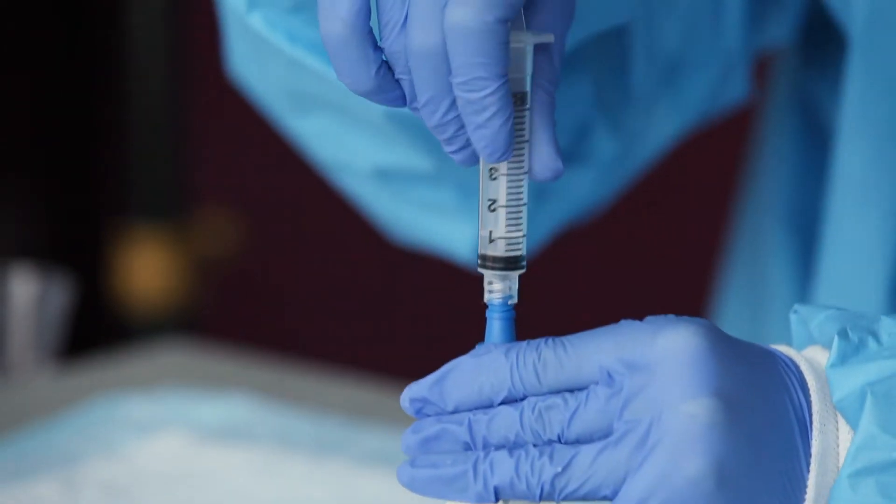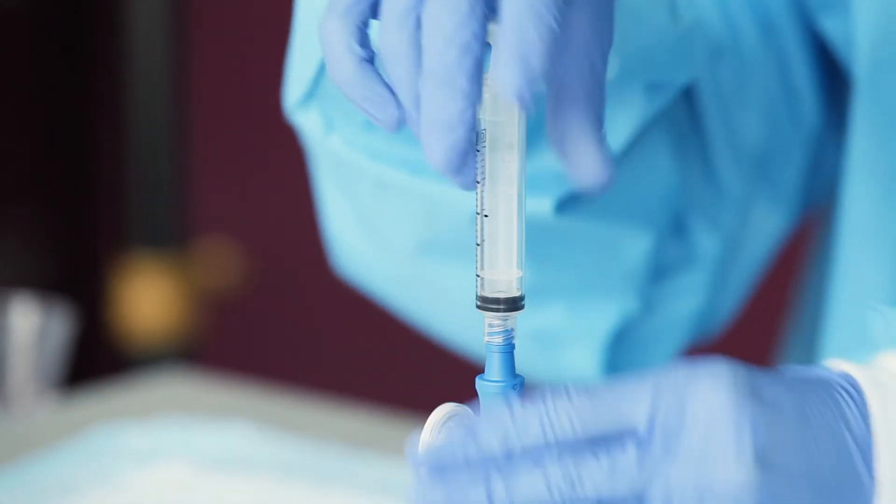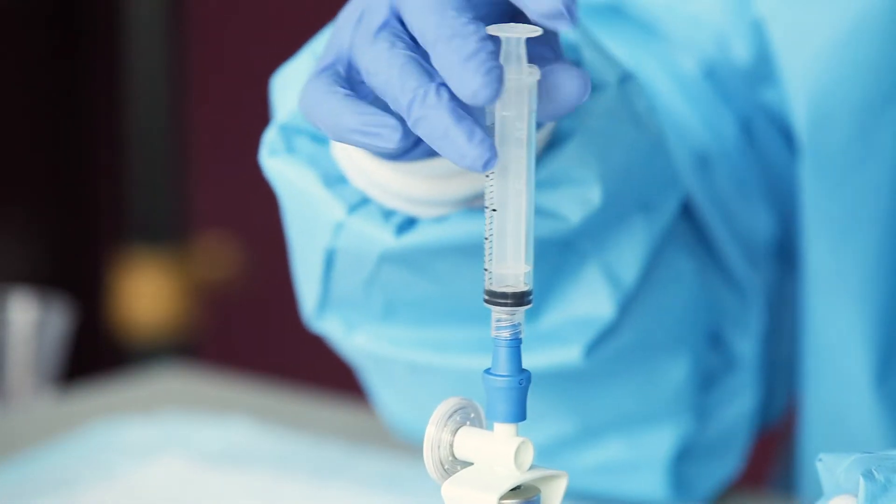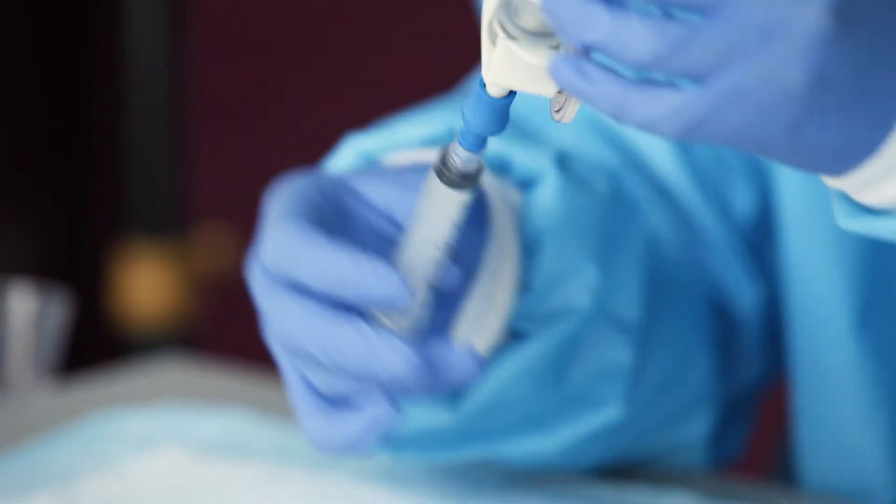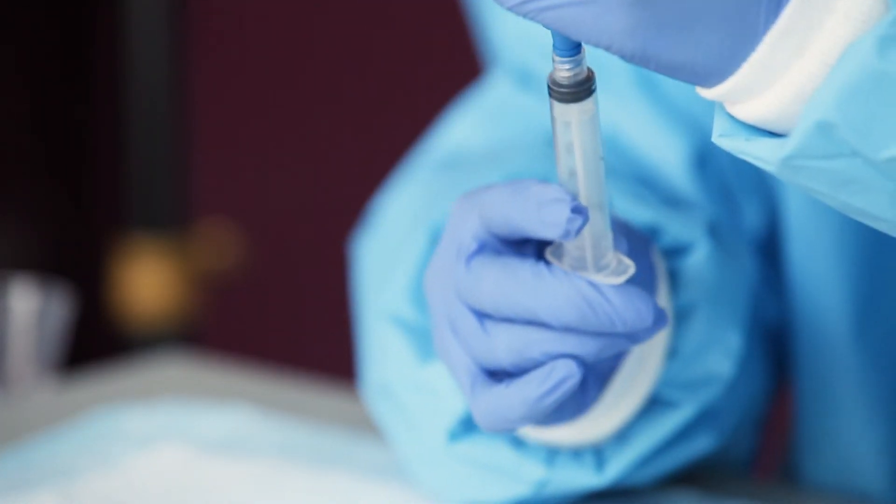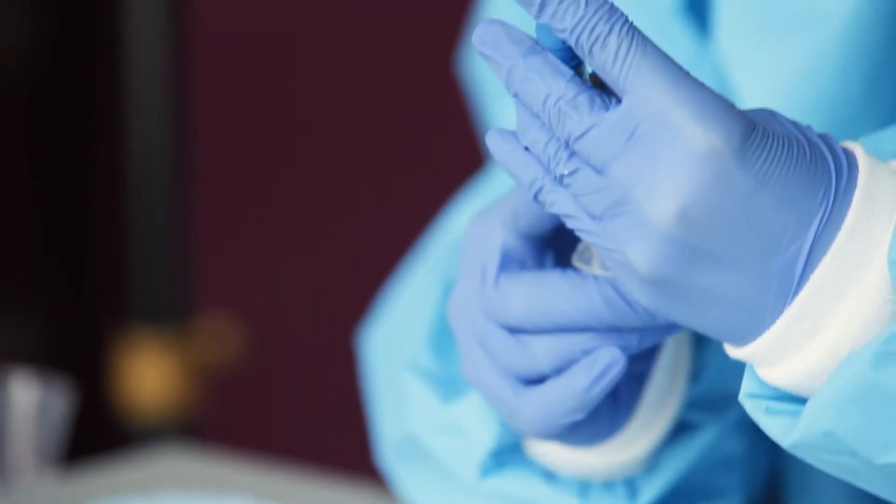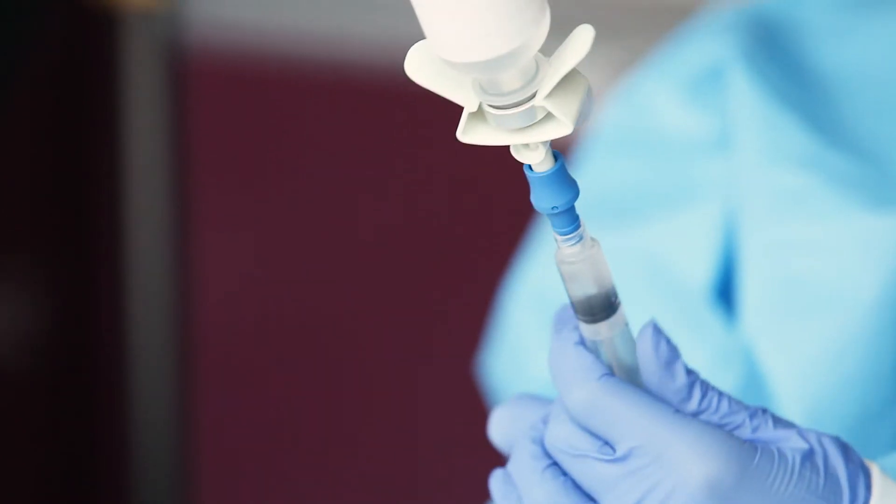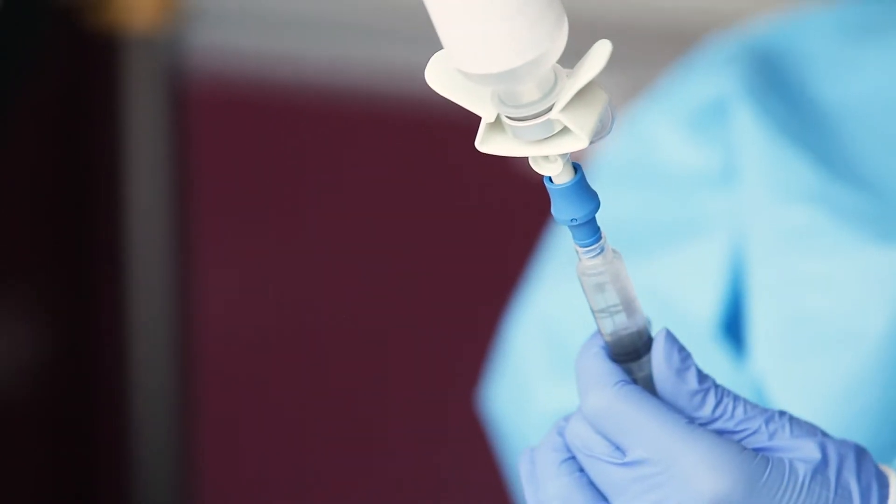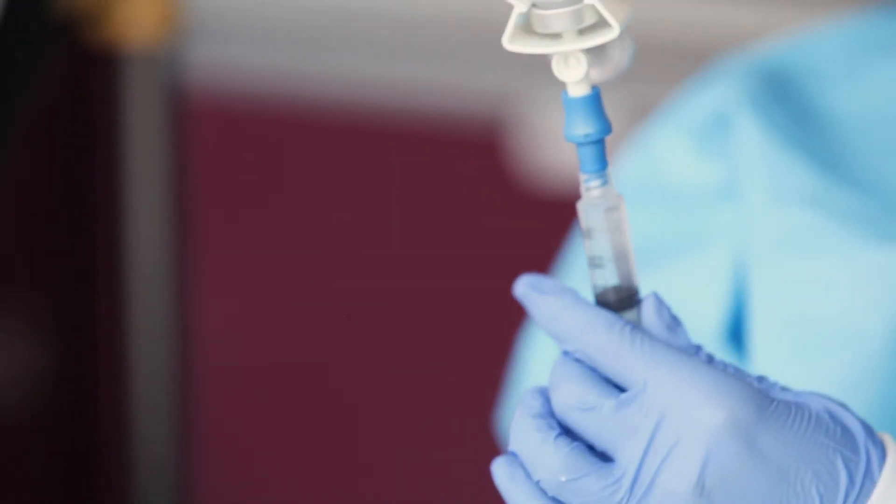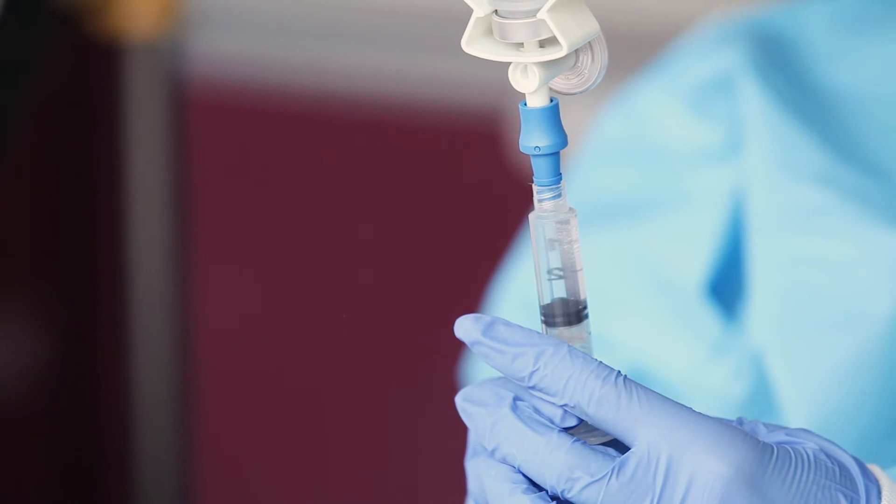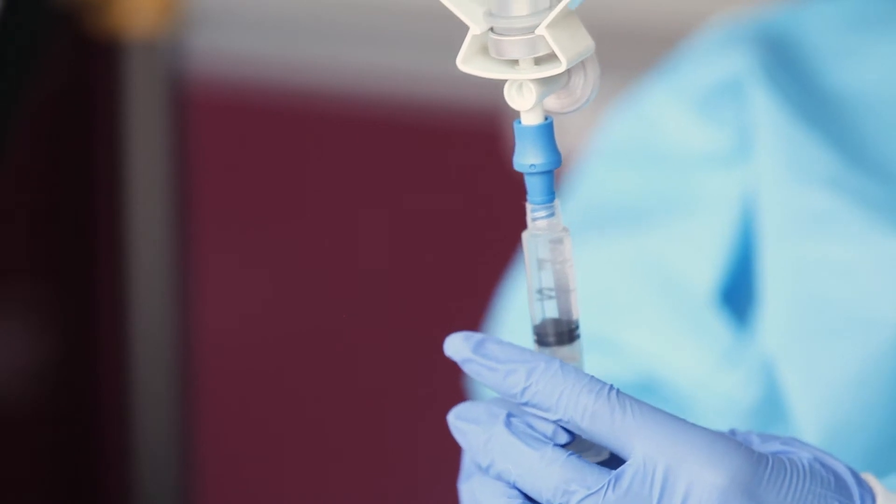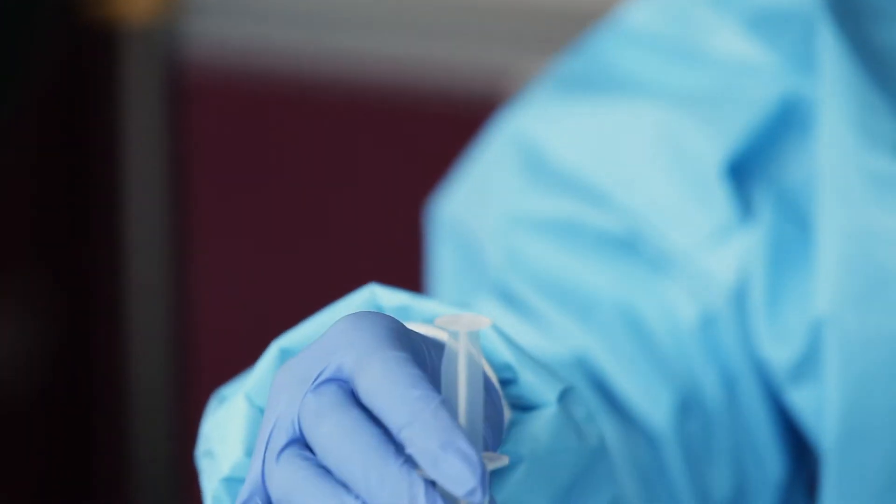Turn the vial upside down and pull back the syringe plunger slowly to draw out the required dose. Your child's healthcare provider will tell you the required dose. If you need to push medicine back into the vial, turn the vial upright before doing so. Remove the syringe from the vial spike.